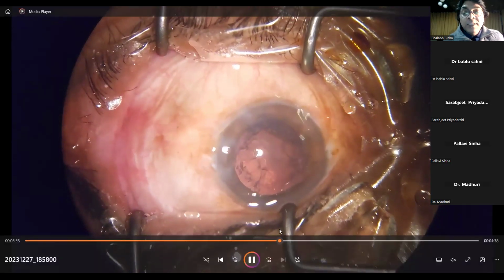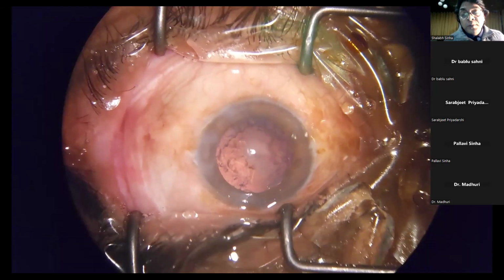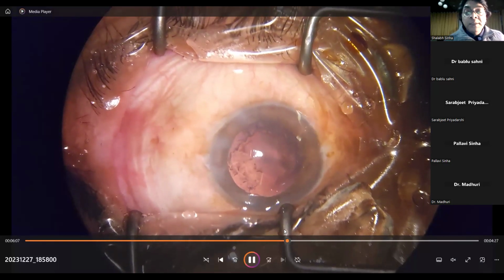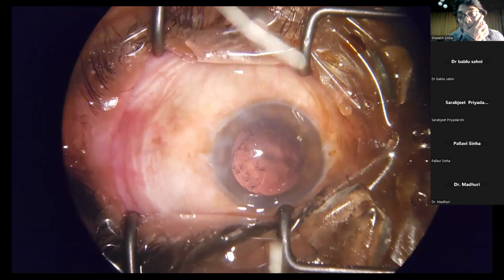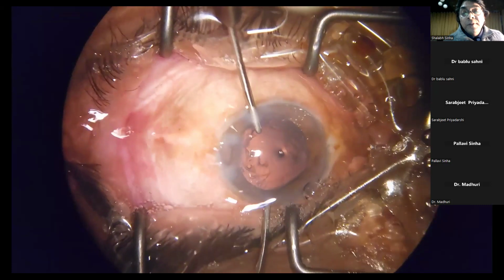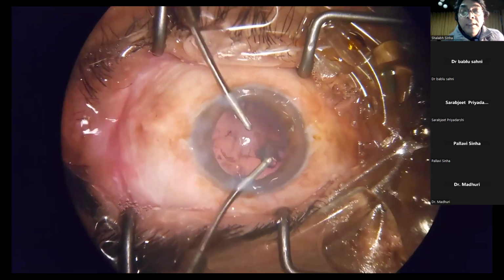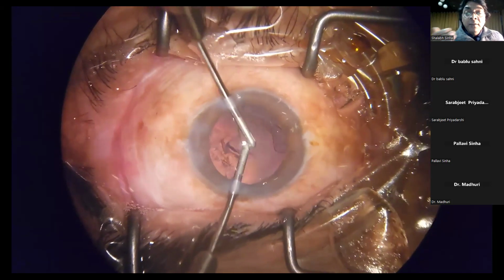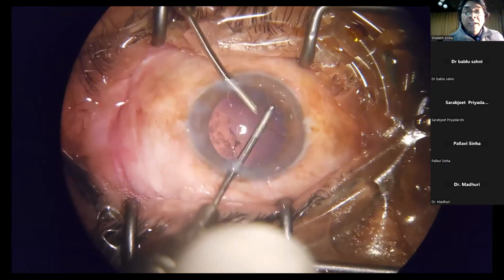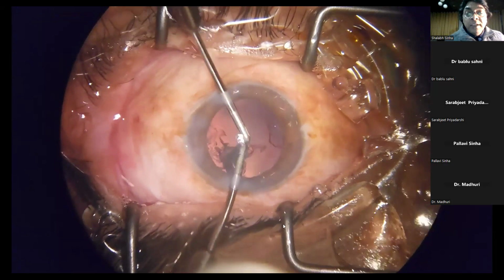And what you just saw was that I always make it a point to inject viscoelastic from the opposite side port, so as to always keep the anterior chamber formed, and this helps in preventing the trampoline effect. The eye is going to become soft, and then you go in, and again when you come out, the eye is going to become soft. That is going to happen multiple times. So one must try and prevent the trampoline effect.